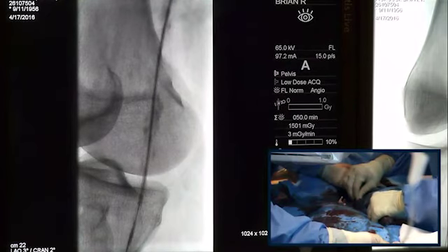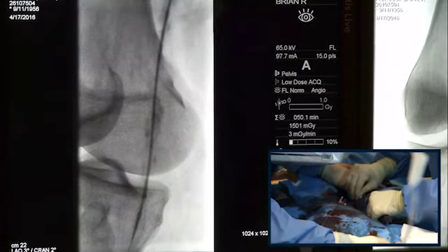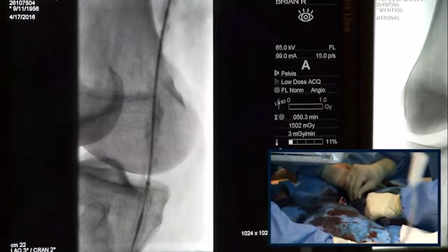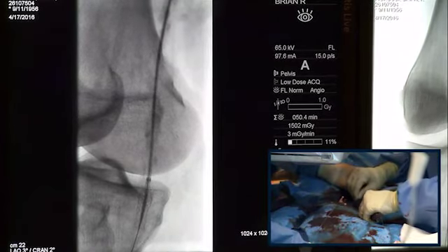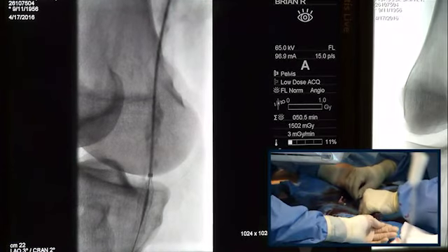So again, for the audience who's not seen this, there's a little bullet at the tip. He's pushing it forward, and as he shoves a ratchet forward, you can see the stent is starting to exit. It's coming out here actually in the popliteal segment below the knee. He's ratcheting it back and holding the restraining sheath. It's a reciprocating ratchet that he is using to deploy this, and by pushing the restraining sheath forward, one can actually pack this stent.